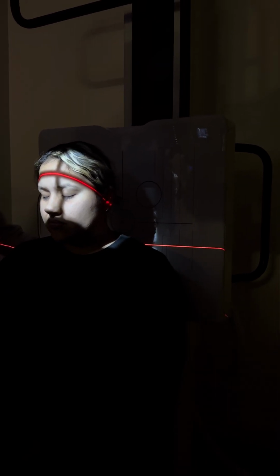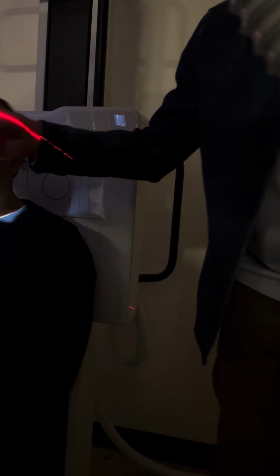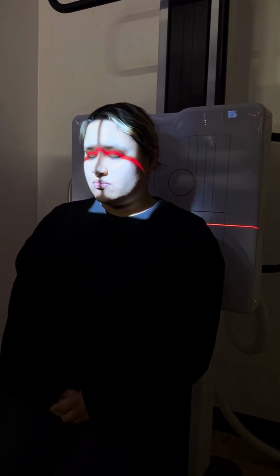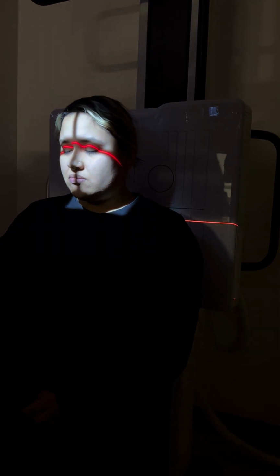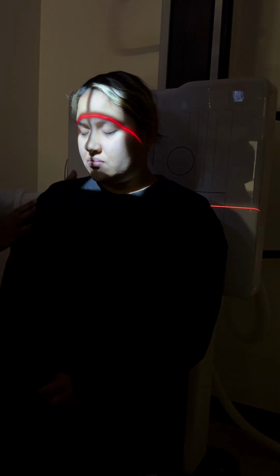Any questions on that? Yeah, so you said for facial bones, we're going to come right to the glabella. That's the area right between the eyebrows. It's between the eyebrows, correct. And it's impossible to distinguish that from the nasion. The nasion should actually be between the eyes, somewhere right there at the bridge of our nose. And the glabella generally is between our eyebrows. For lots of people, there is no real distinguishing property on that. Do your best. I'm not that fixated on it. You'll actually give me the right projection I want for that.